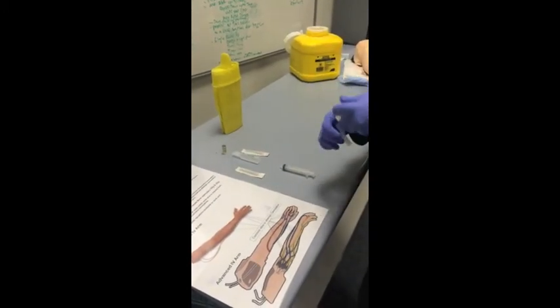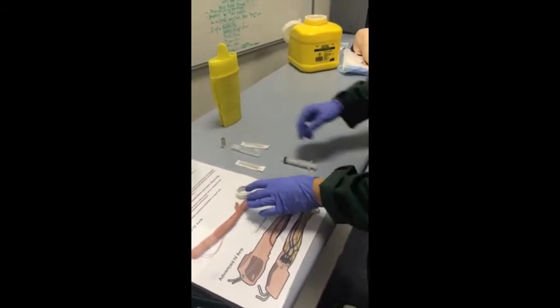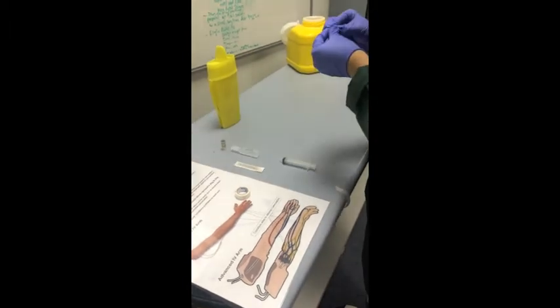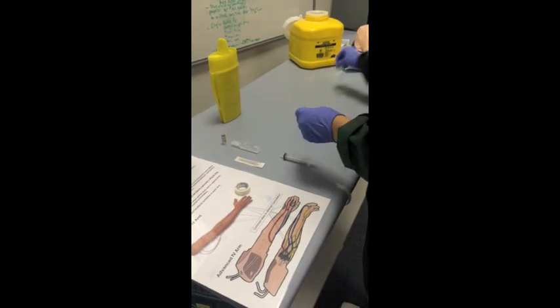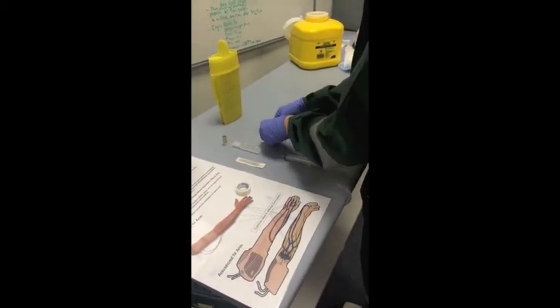The appropriate equipment required to draw up IV fentanyl from a glass ampoule includes a blunt drawing up needle, a 10ml syringe, 10ml of normal saline, and 2ml of 100mcg of fentanyl. I am using gloves to ensure sterility of the equipment along with protecting myself.